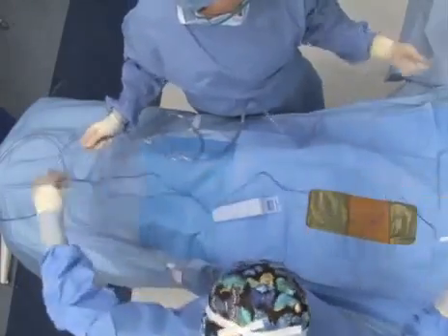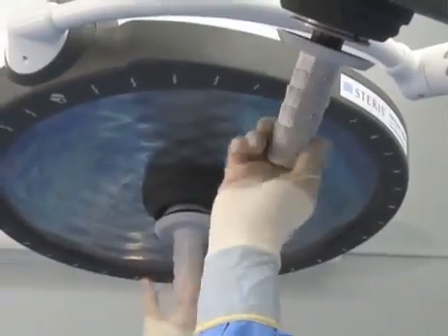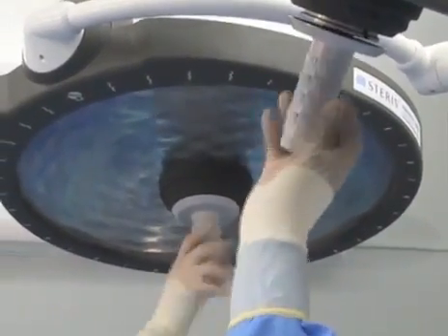I might want a Megadyne tip also. Get that for me. The sterile light handles are given to the surgeon, who attaches them to the operating room lights.